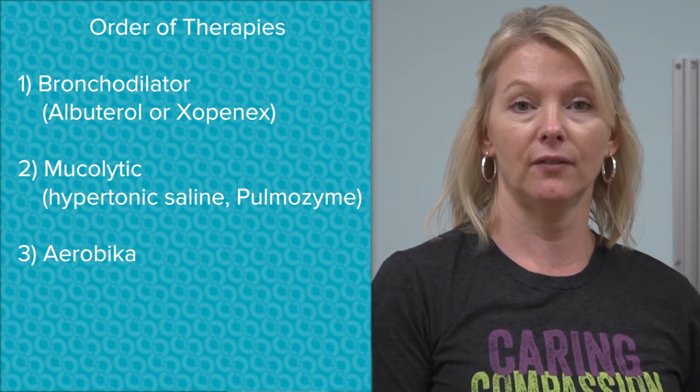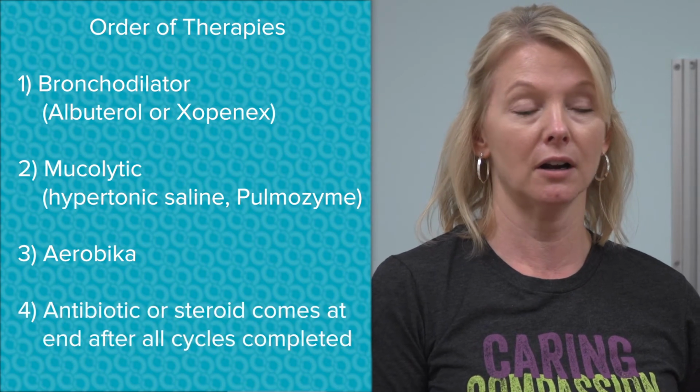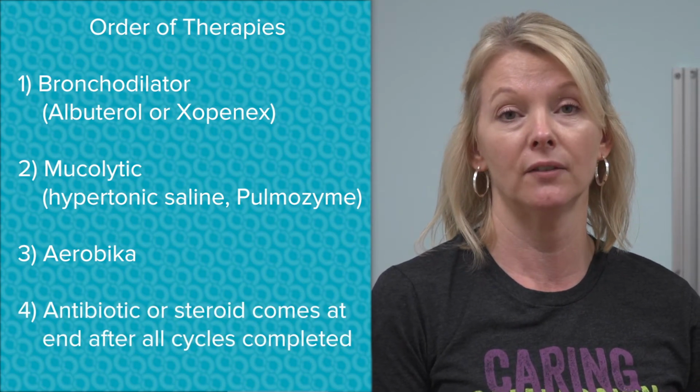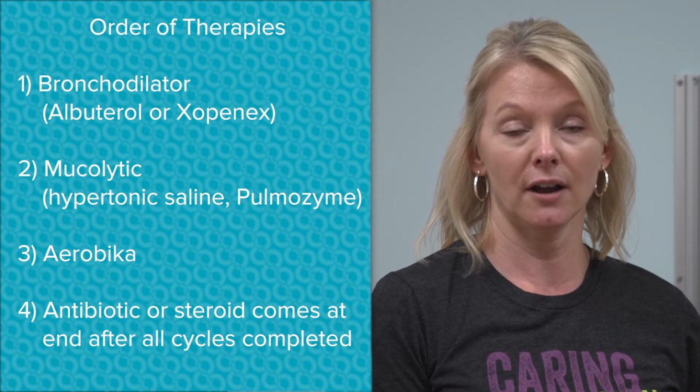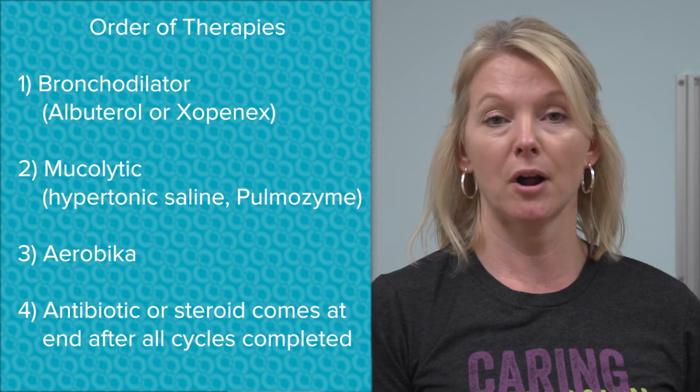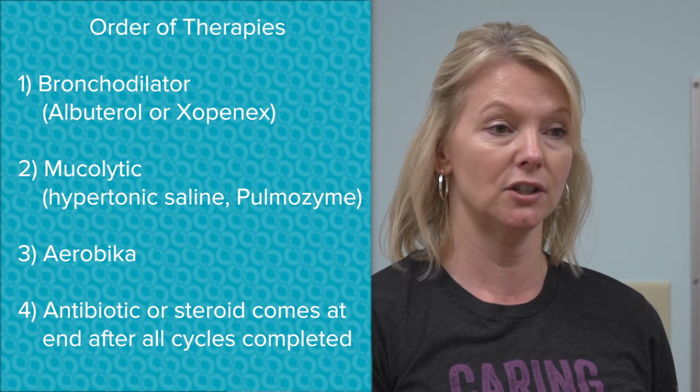And then if they're on any kind of antibiotic or steroid, of course, that would come at the end of airway clearance after they've done their 6 sets of 15 with this and done all their huff coughs. Then they would do their antibiotic or steroid, what else they have left to do.